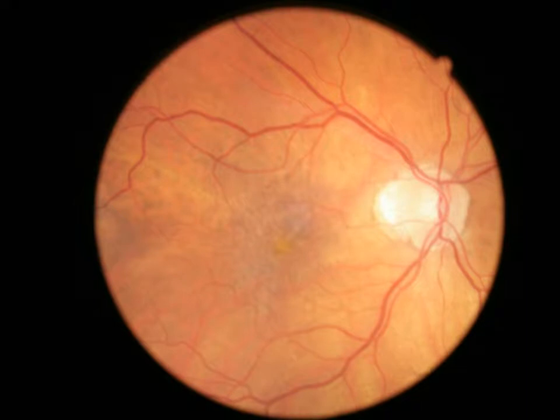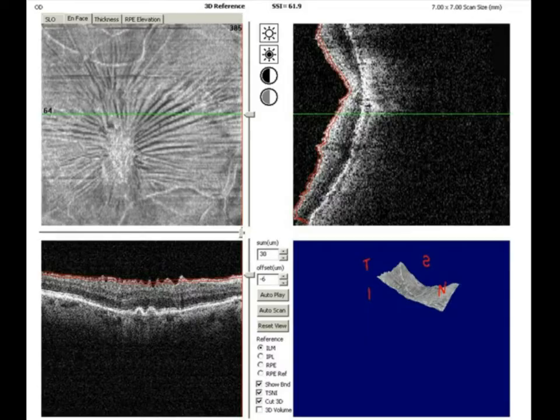And we're looking at the fundus photos. We're looking at the physical examination. We're physically inspecting the fundus, and we're unsure why that's happening or why there's a discrepancy in the vision. But it's remarkably telling when you actually look at the OCT scans. Again, remember that even though I identify these conditions and these retinal states as separate items, they're oftentimes occurring in sync with one another, or there may be multiple conditions that we're actually managing or monitoring, like this individual.